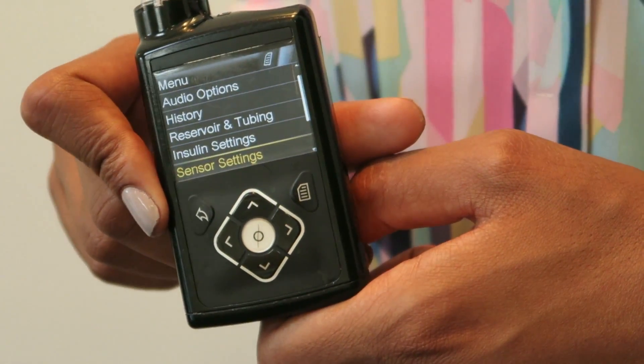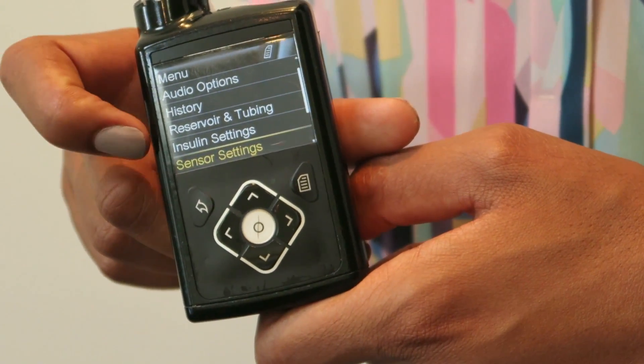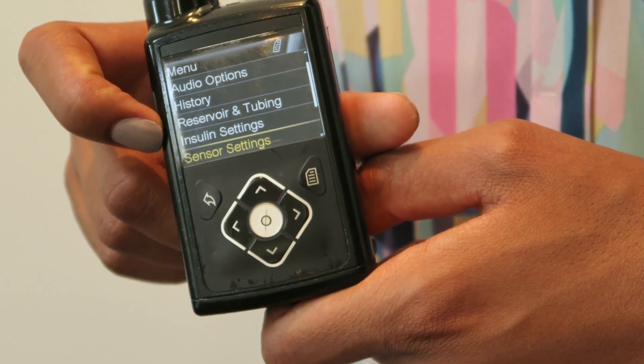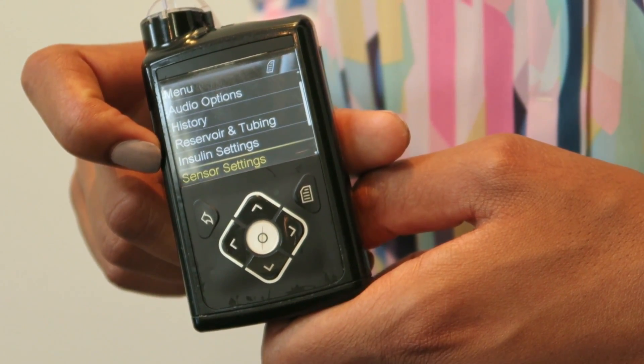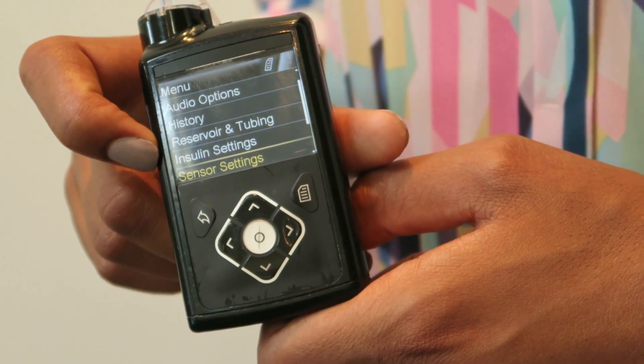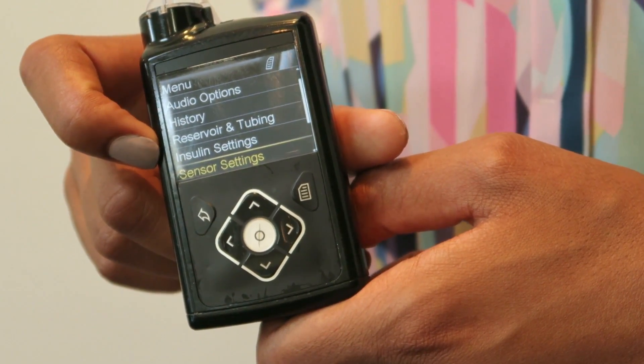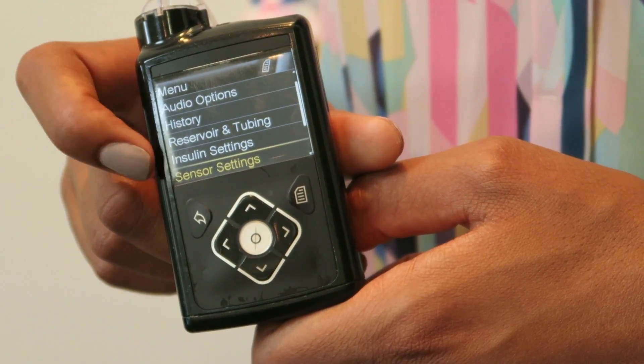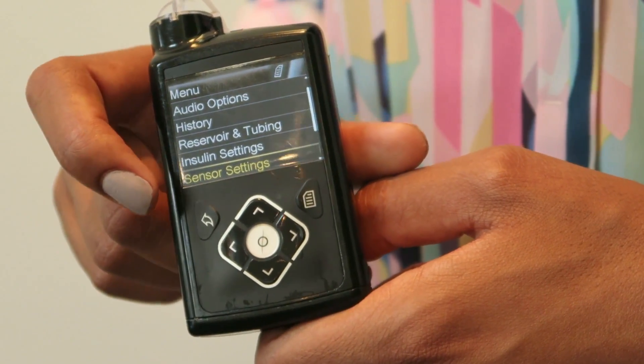The sensor settings are the next option, so if you needed to start a new sensor or reconnect it, this is the option that you choose.